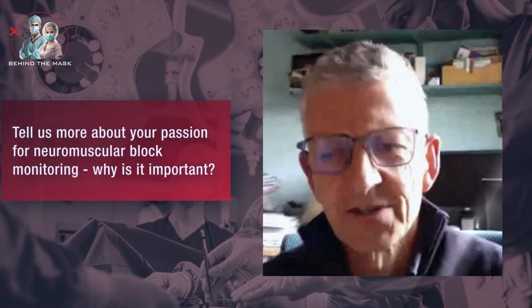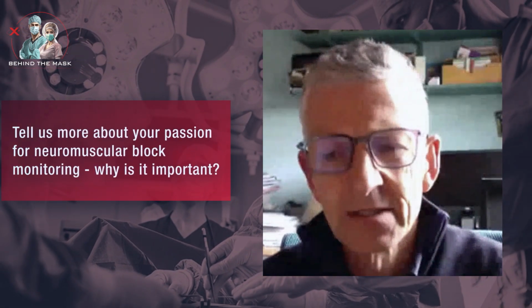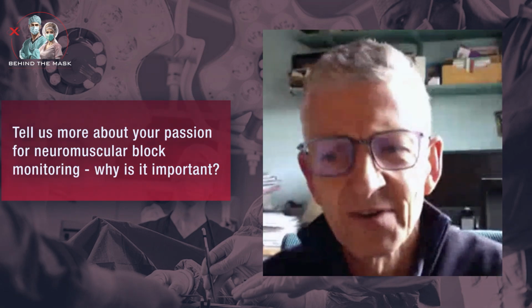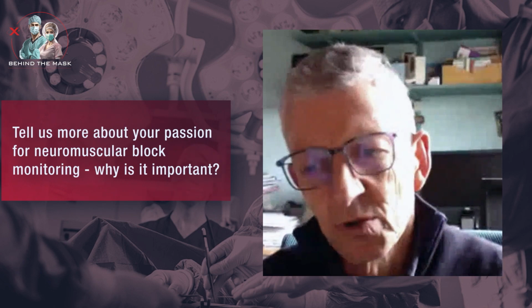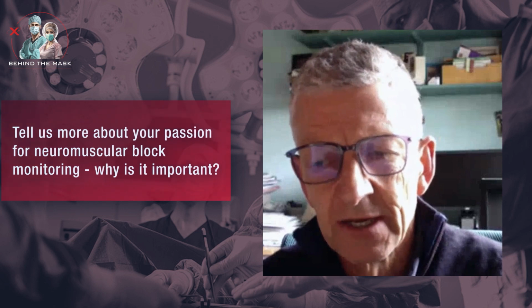And you are involved with device evaluations, trainings, education, seminars, webinars, this interview. So can I say that you have a particular passion for neuromuscular monitoring in enhancing clinical practice? I'm not sure why, but I've always had an interest. I've always been a twitcher. I started out using standard peripheral nerve stimulators to assess the quality of recovery of my patients, and then moved as we moved towards more availability of quantitative neuromuscular monitoring devices.